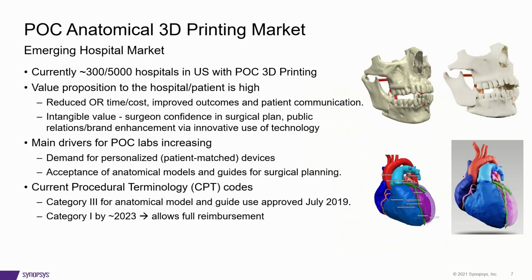Looking at the emerging hospital market, currently there's roughly 300 out of the 5,000 or so eligible hospitals in the US with point-of-care 3D printing facilities. The value proposition for the hospital and patient is quite high. It has reduced OR time and cost, improved outcomes for the patient, and better patient communication.